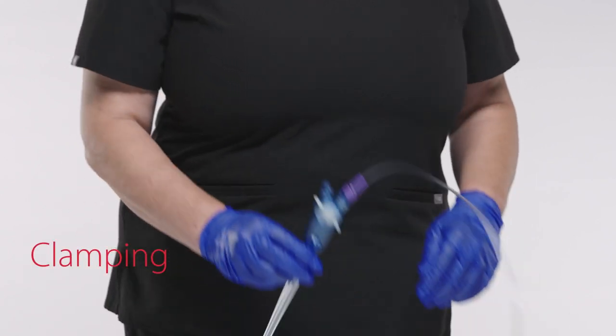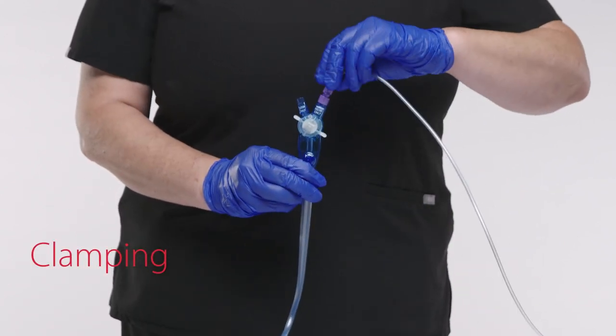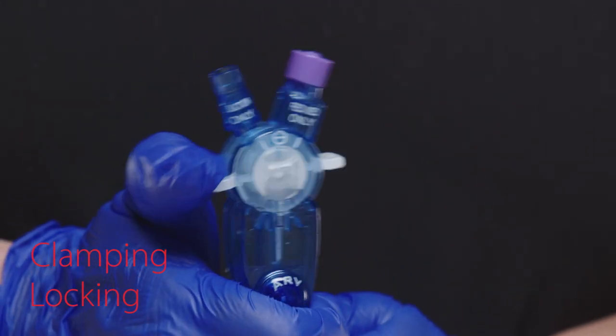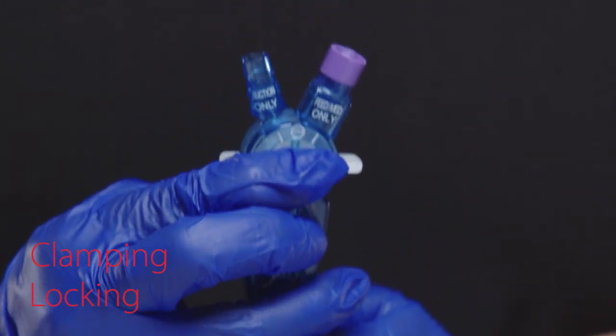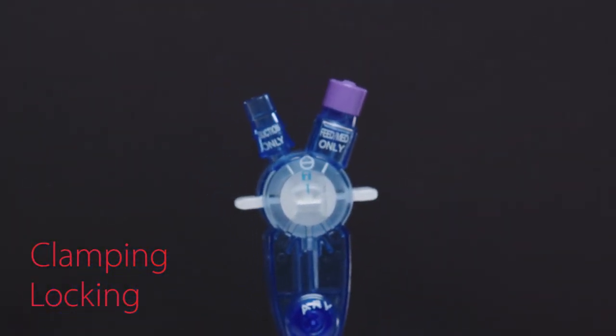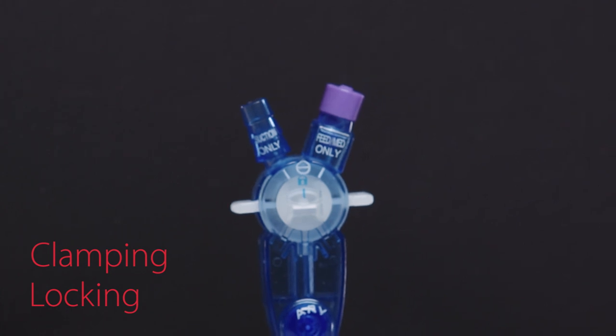Slide the knob to the middle to clamp the tube during a procedure or transportation. To lock, slide the top down at any position to reveal the lock sign. This will lock the knob during any of the various functions of the tube.